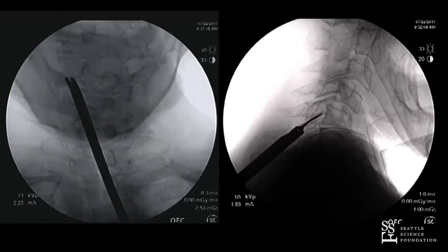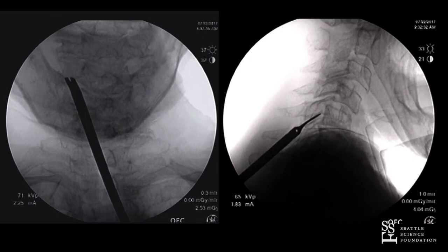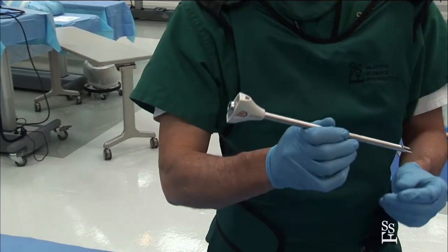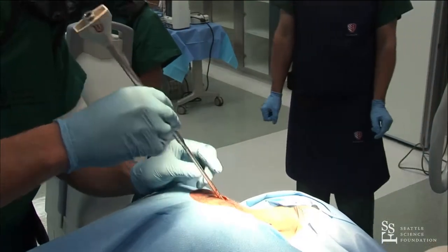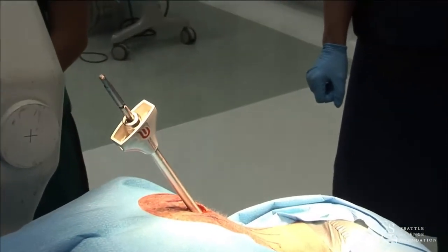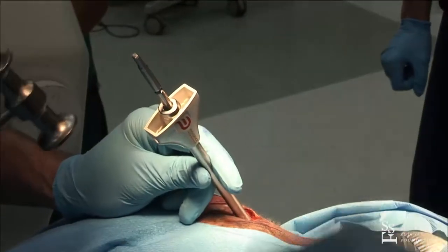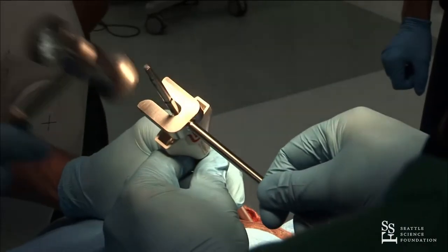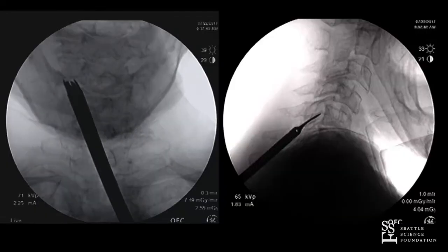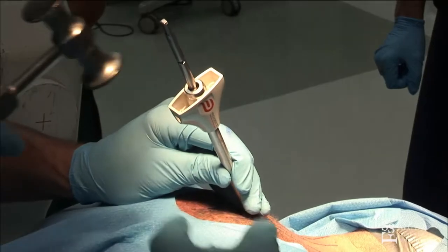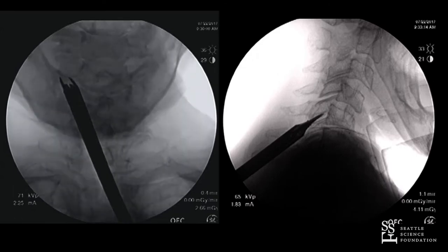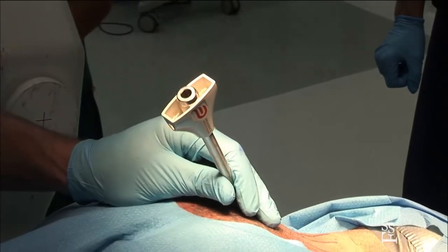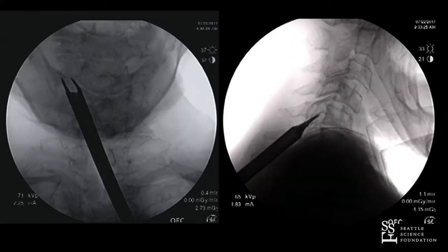Sometimes when you're working that, you can pull out a little bit. Let's just take a check on AP and lateral. Looks okay. Now this is the working channel — this is a guide tube that inserts over that and maintains distraction of the facet joint. I'll have my assistant hold this. So it's backed out a little bit. So once that's in, I take out the initial facet access tool. I could have a little better trajectory or higher up, but I'm in the facet.